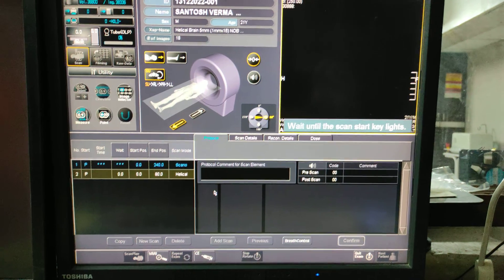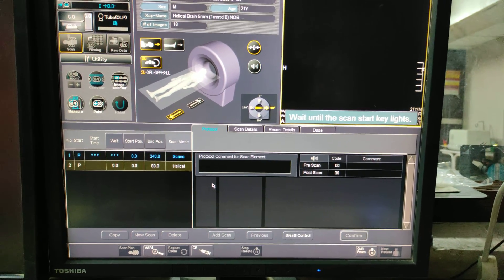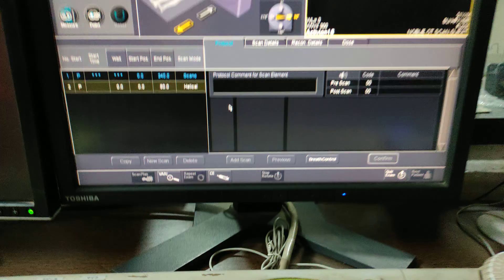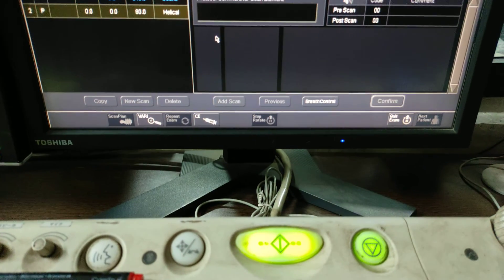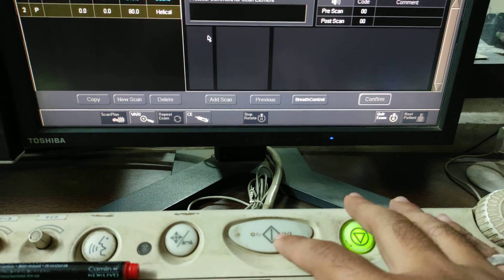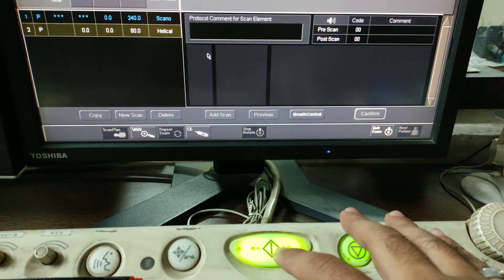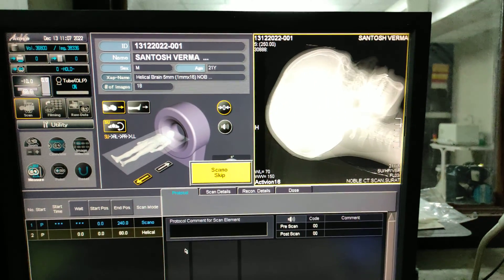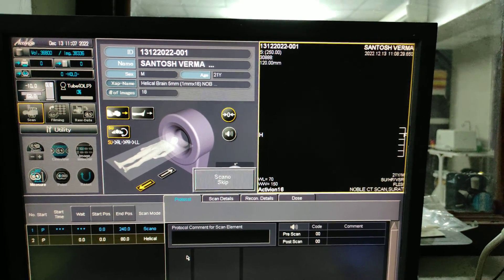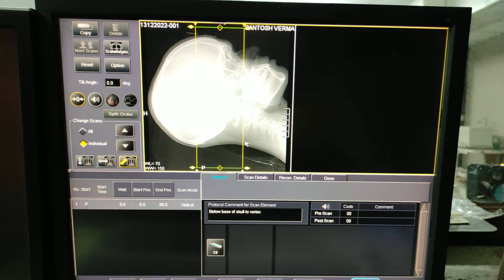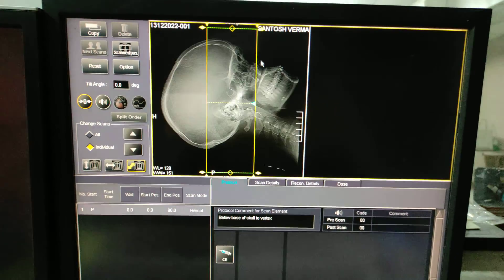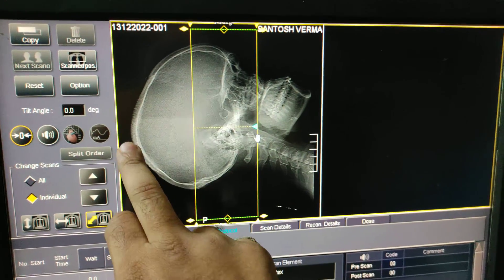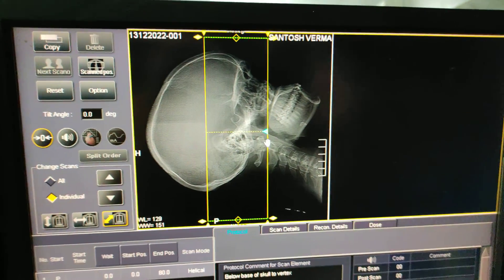You can wait until the scan start key lights up. Here you have to click two times. First, the scanogram will appear — this is the scout from mandible to vertex. This is the scanogram.